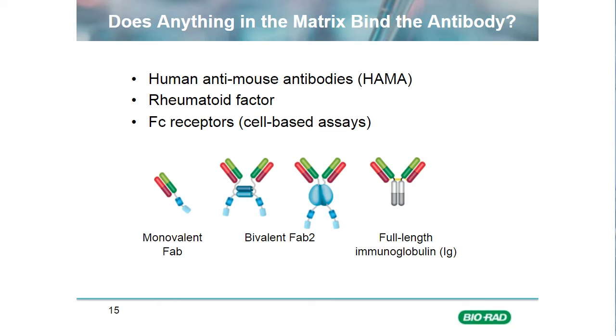So some human serum samples contain antibodies that will bind mouse IgG, and these can either short-circuit your assay or they can mask your capture antibodies, assuming that your assay uses mouse capture and detection antibodies as its critical reagents. Now, at the assay level, you can use something called HAMA blockers, which is essentially non-specific mouse IgG that you spike into your reaction buffer. And this should mop up any HAMAs and stop them interfering with the components of your kit.